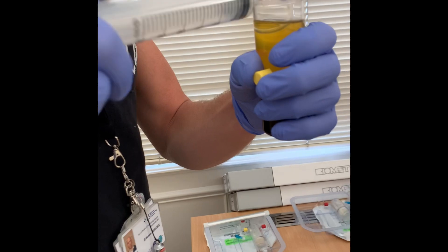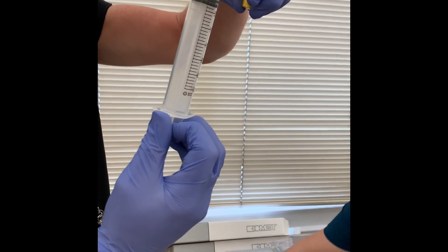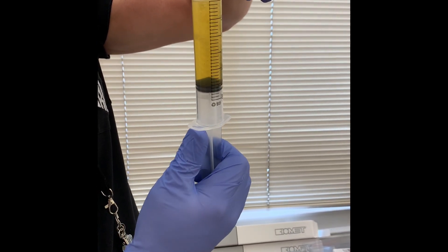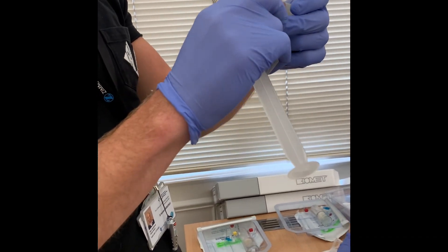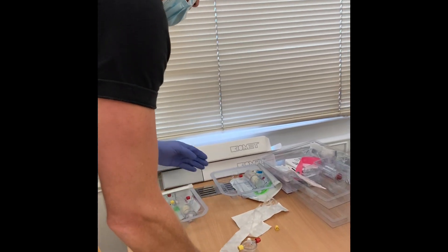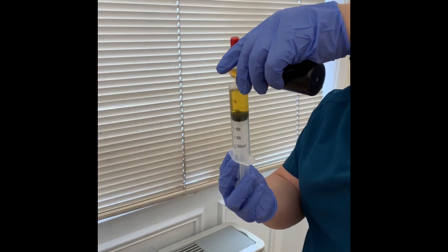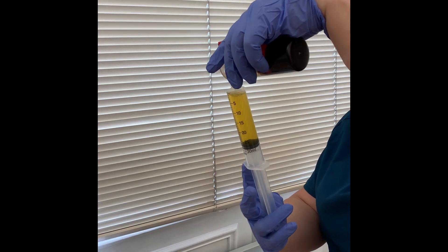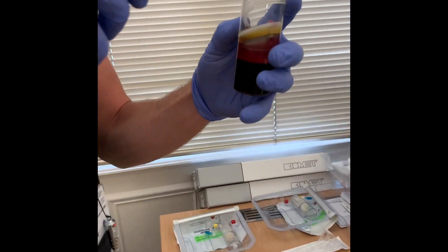15 — sorry, no, go for it. So this is a good bit, coming off.